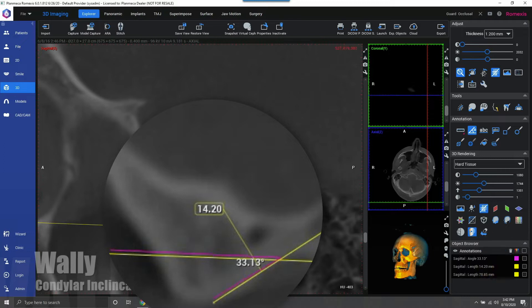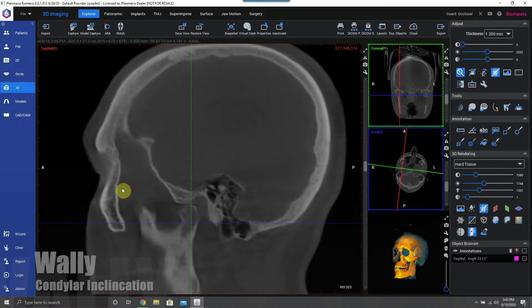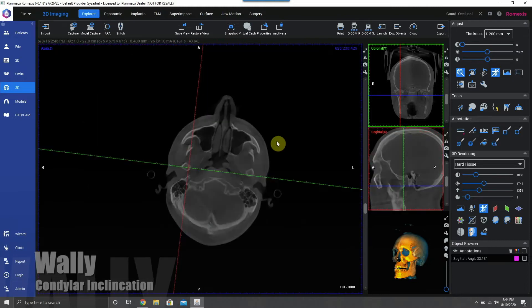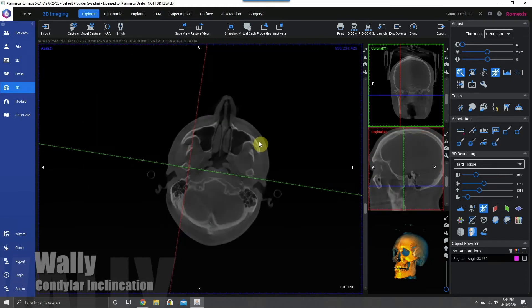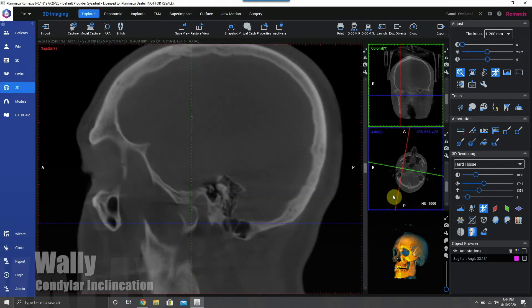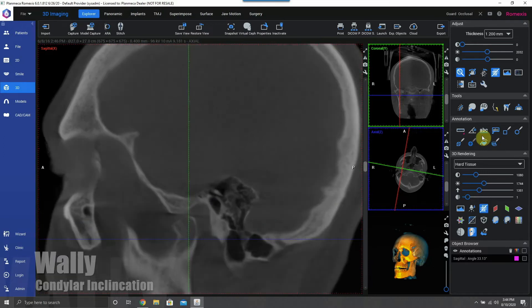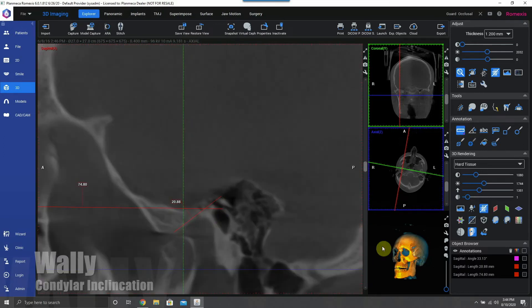We'll save that and then repeat the same steps on the contralateral side, going over to the patient's right side now. You do have to alter the tilt of the patient in order to get the external auditory meatus, the inferior border of the orbit, and the condyle in the perfect cross-sectional plane view.